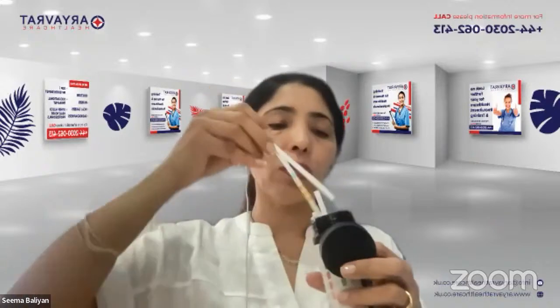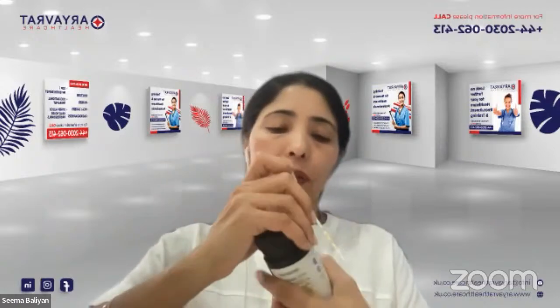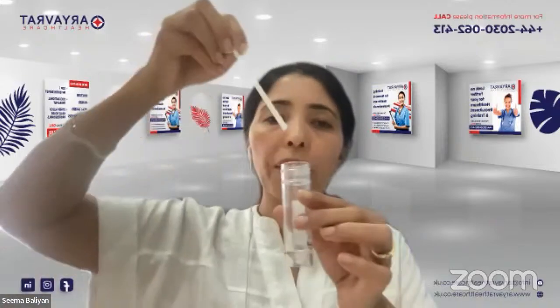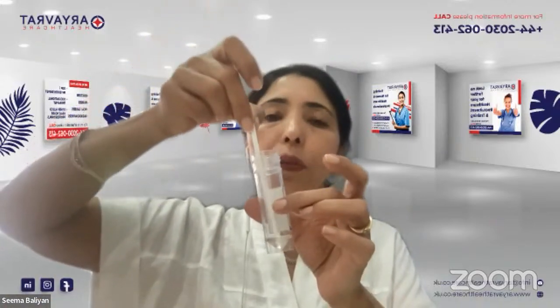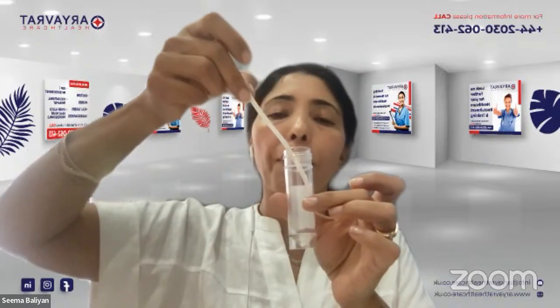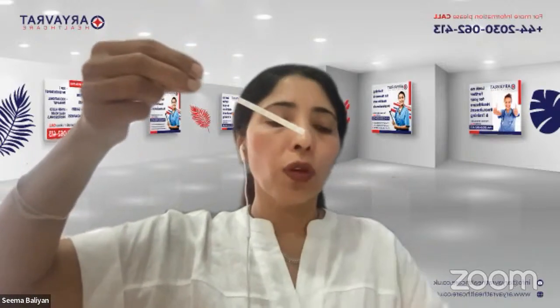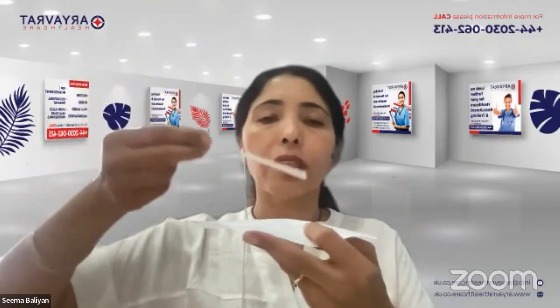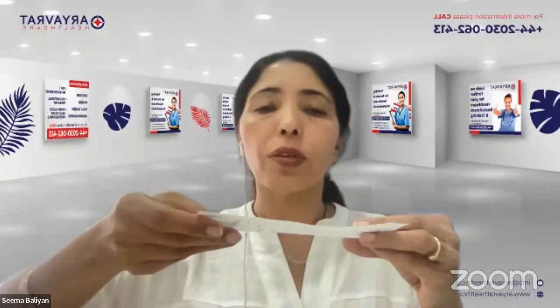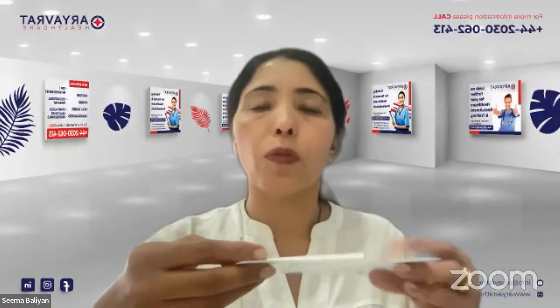You will take that one out, making sure that you are only touching the top part of it, and you will close this one back. And then you are going to be dipping it into the bottle, making sure that all of the boxes are dipped in the urine. And then while coming out, you are going to drain the excess urine, and you are just going to put it on the tissue paper. So imagine this is a tissue paper. You are going to be putting it on the tissue paper for the excess urine to be drained into that. And at the same time, you will check the time, at what time you did that.